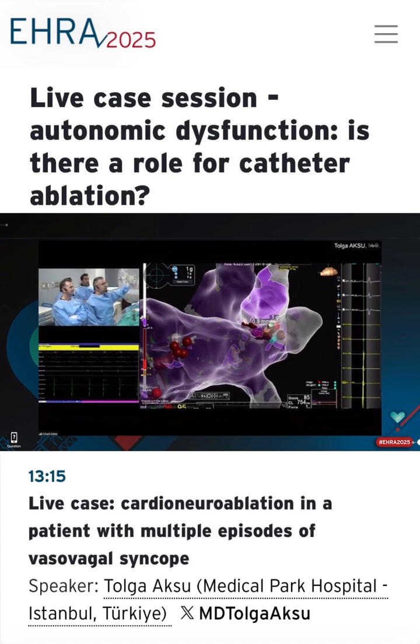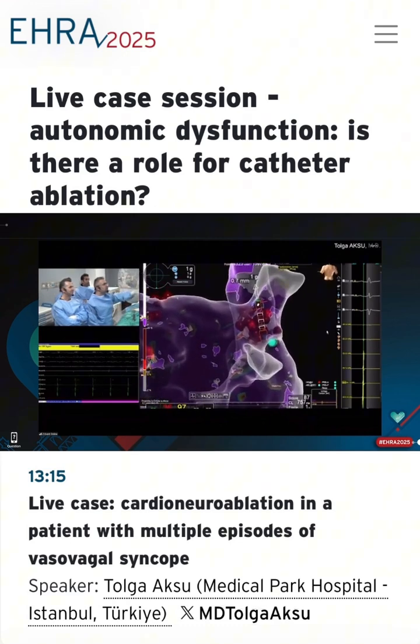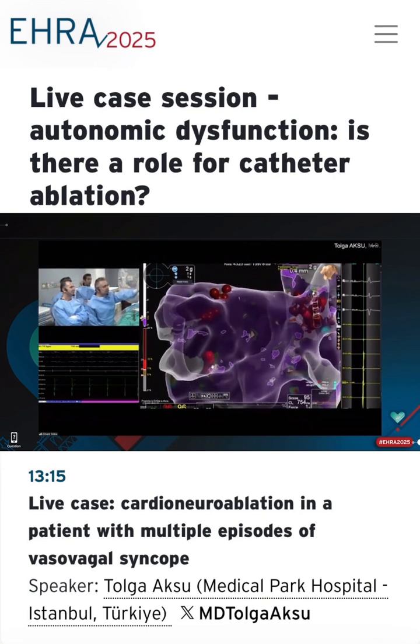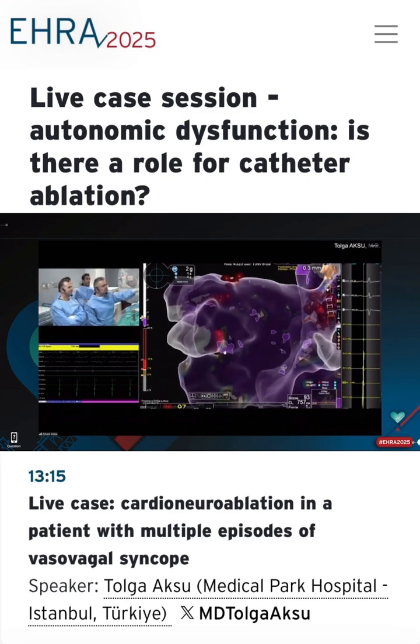And please turn to posterior anterior view, PA. Left inferior. Show with an arrow. Left inferior. Yes. This is the left inferior GP, found by combining fractionation and peak frequency. We didn't see anything on CT because this is a very tiny GP, but both peak frequency and fractionation mapping show the same area, and we also saw a fragmented electrogram on that site, so we ablated this site as well.